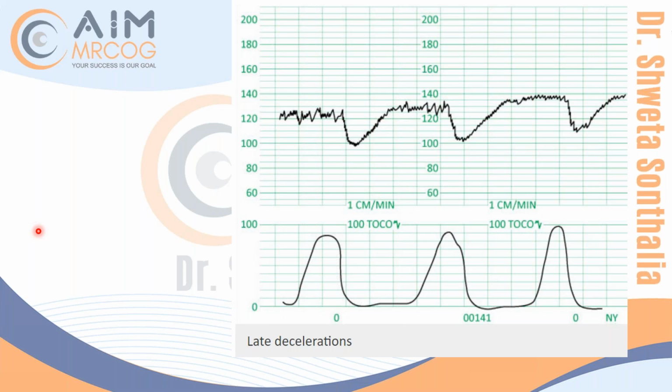Baseline 120. Yes, 120. And then here it became, but at least 10-minute trace we should have. If you see here, it started with 120, or maybe I will say 120 to 125 somewhere. And then if you see, gradually the baseline is rising. Now it became 125, then it became 135, almost 140. So you're seeing that the baseline is rising, 140, isn't it?